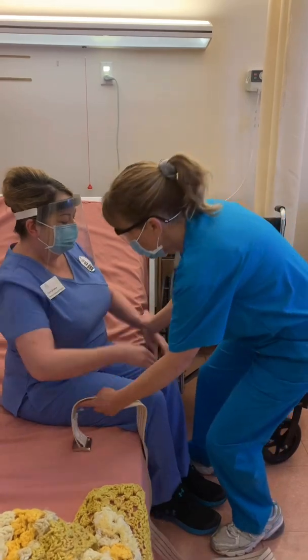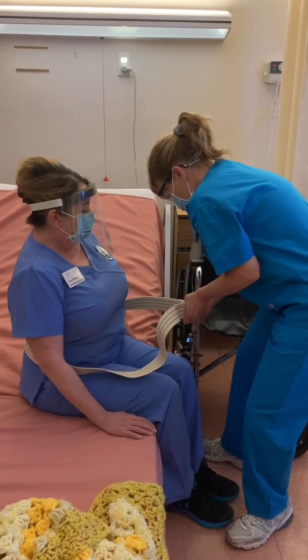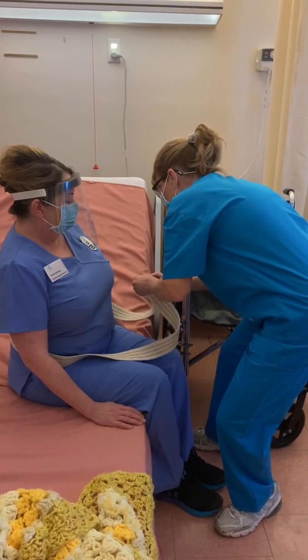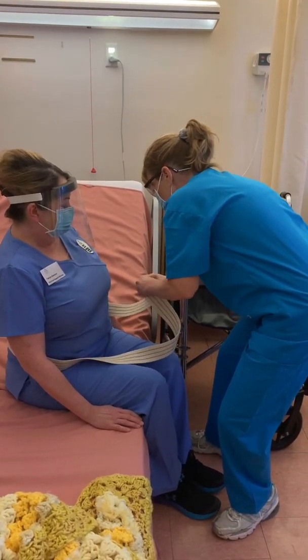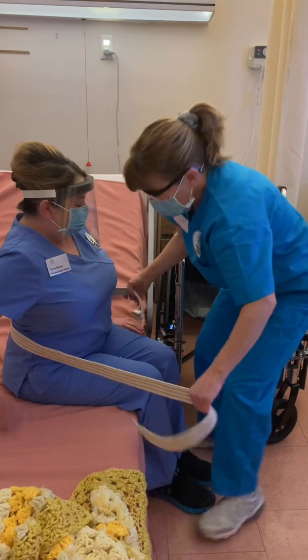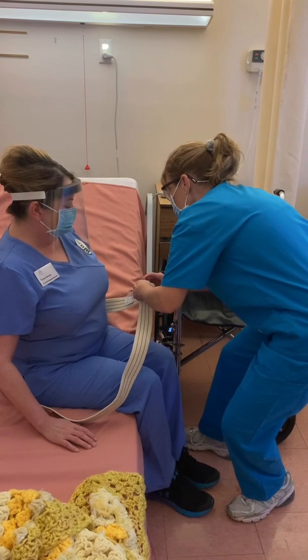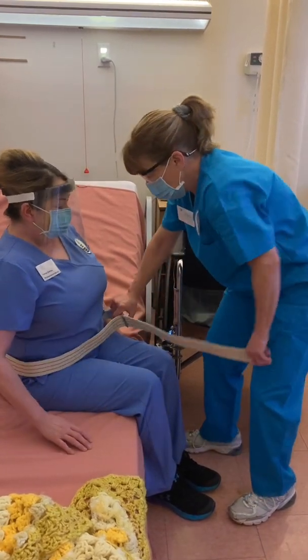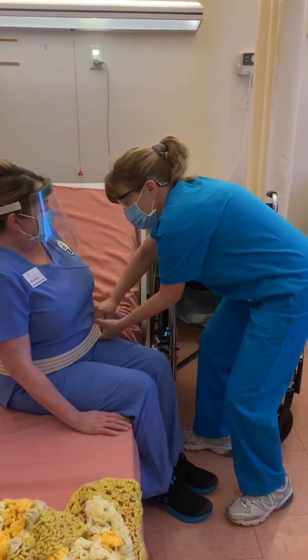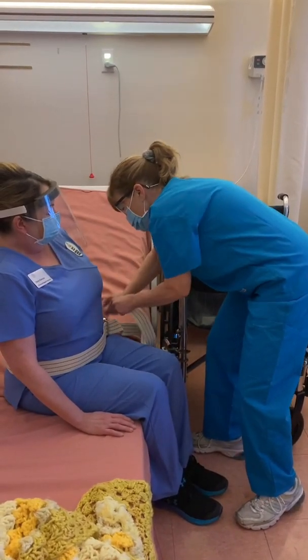Sure. So if you raise your arms for me, are you able to? I'm going to just put this down here. There we go. Oh, I've got it the wrong way. Just going to readjust it here. So do you know what's on the menu for lunch today? Hopefully soup. Oh, yes, I believe it's a nice vegetable soup. Do you like that? My favorite. Oh, good. How does that feel? Fine. Just going to tighten it a little bit. And secure the belt to the side.